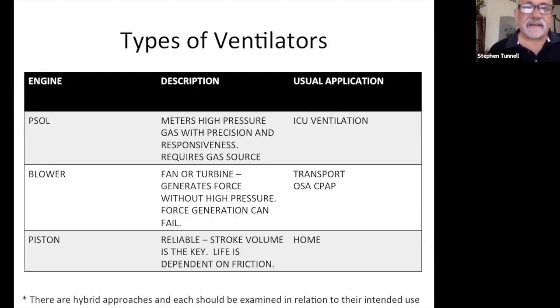So let's talk about ventilators. There are many ventilators out there, but not all ventilators are created equal. There are huge differences in the quality of mechanical ventilators. So what is the importance of a mechanical ventilator, or what are its functions? As we talked about in the previous slide, it has a therapeutic function. Remember, it's going to supplement oxygen, help drive up and manage oxygenation, remove CO2, and take over the work of breathing.